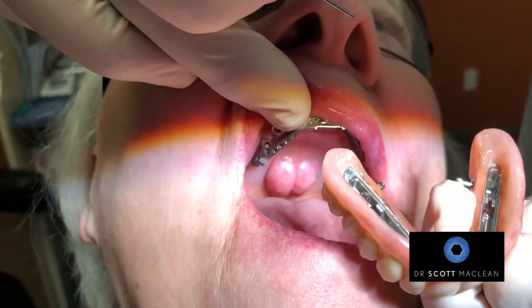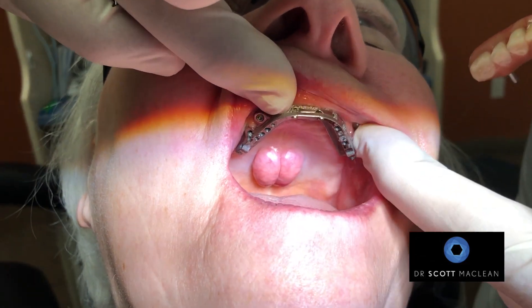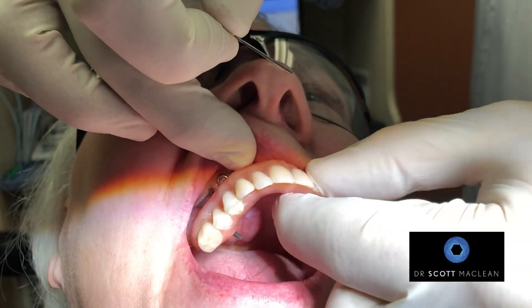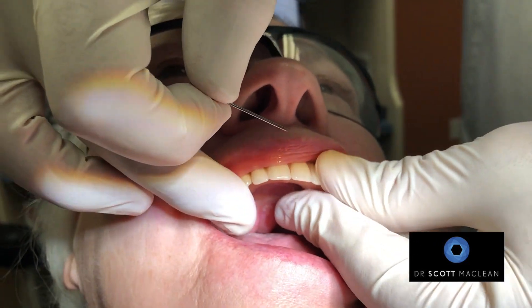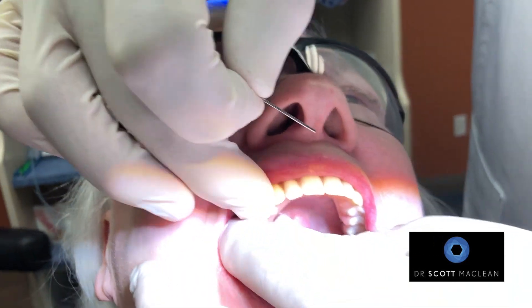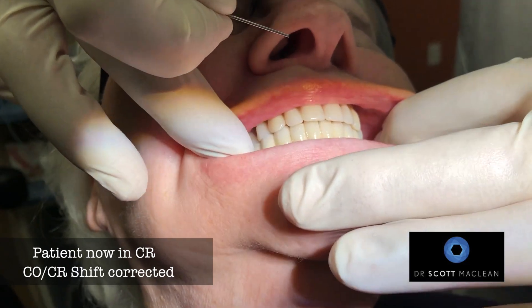This has been very successful for her. She showed up to me with a fixed bridge that she couldn't clean, that was ill-fitting, had problems, and she's a clencher. So putting this back in, we still have to be concerned about clenching. We push this in, push the other side in, and then we just bite together — you can see the occlusion.